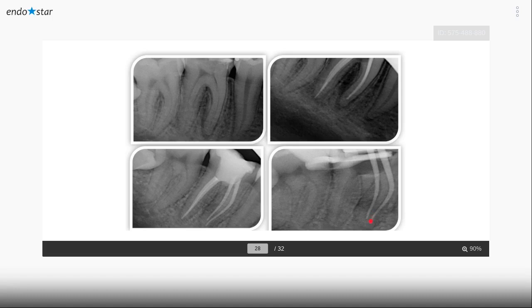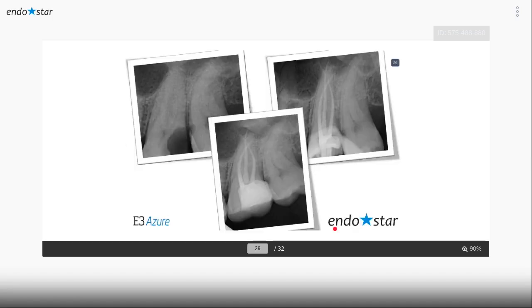So I can easily go to the proper working length, which was confirmed by the X-ray and the apex locator, and I got this result by only two files. And by the way, the patient is not young, he's above 50. So the mesial canal wasn't that easy a situation, but done with only two files. Let's go to the upper 7.